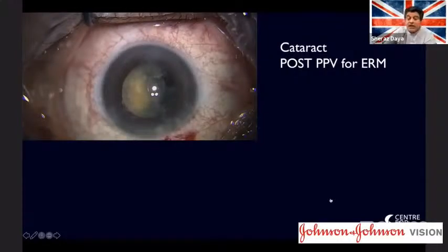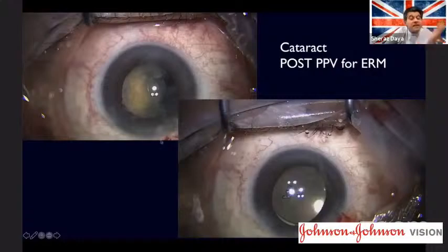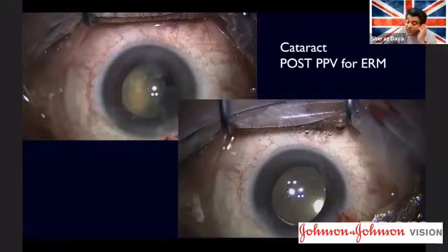And I went ahead. And you can see this is after doing FLACS, I could see the lens descending before I even bothered to do anything. And that was it. It went into the back of the eye. I called up my retina guy, Tom Williamson. I said, what do you think I should do? Should I just leave them for you to deal with? And do you want me to put a lens in? He said, no, I'll put a lens in. It'll save me the trouble of opening his incision again. And hopefully he won't have any retinal tears or anything. We won't have to put any gas in. So that's what I did.